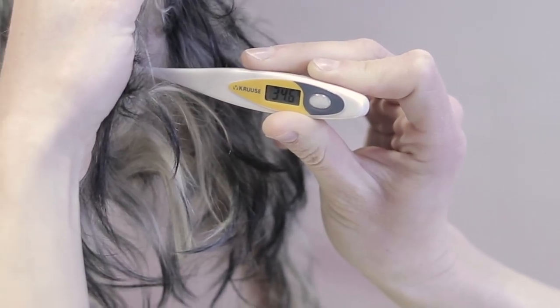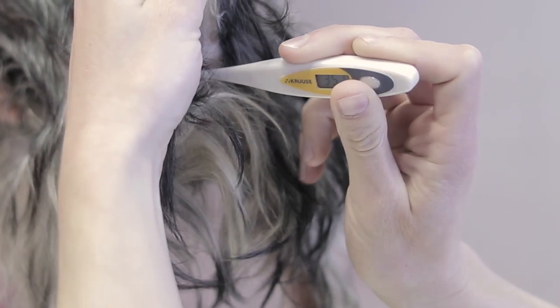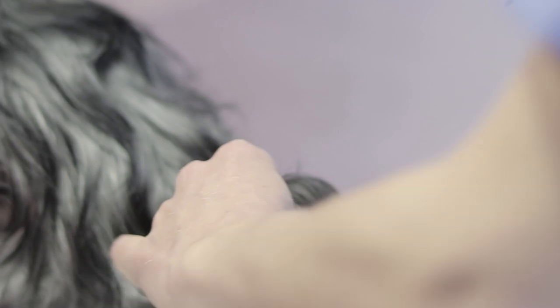To take a rectal reading of a dog, we cannot use any household thermometer. Instead, we need one which is designed specifically for animals.